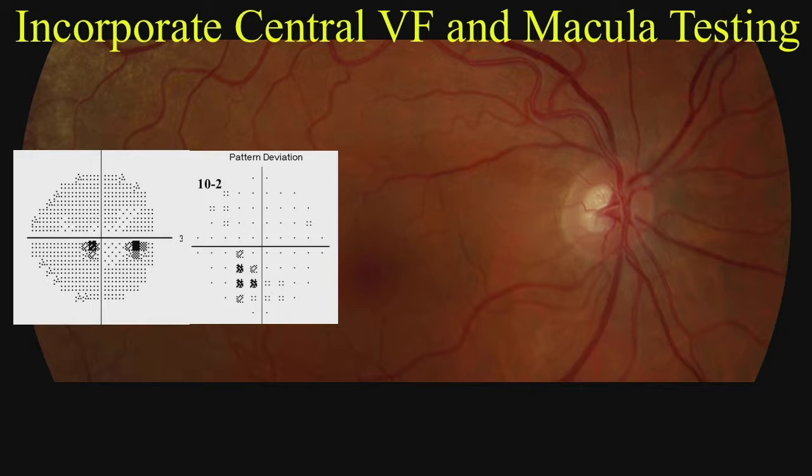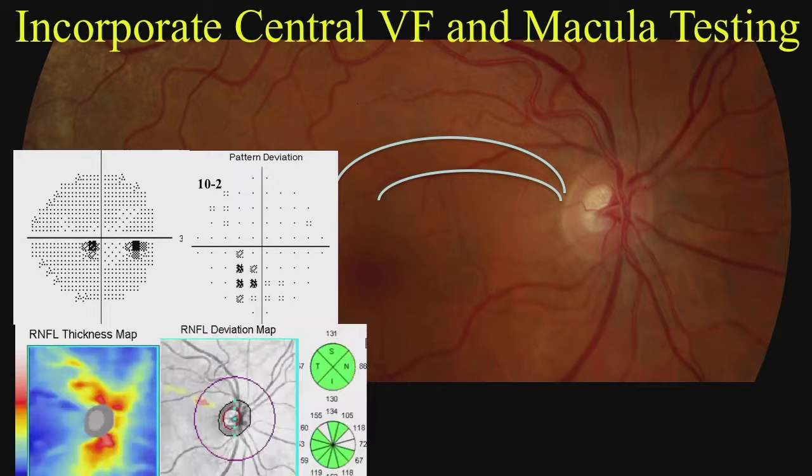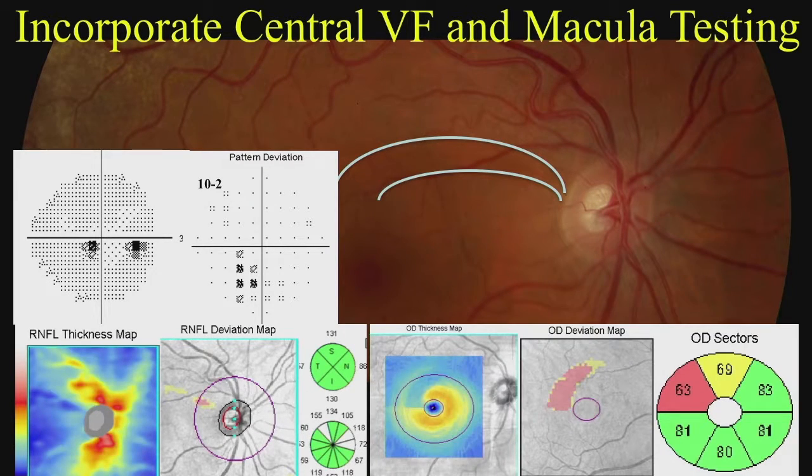They're also useful in eyes with early glaucoma, such as this eye with a paracentral defect, an abnormality that could be clinically seen in the superior arcuate nerve fiber bundle, but it escaped detection on the parapapillary nerve scan. But we did see this uncovered in the macular GCIPL.